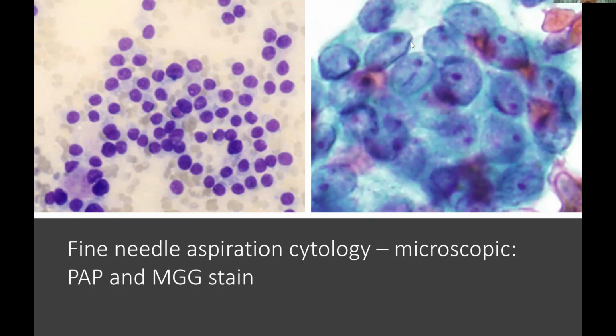The nuclear features of the thyroid cells are vesicular, meaning you can see clearing of the nuclear features. Here you can see grooving inside the nucleus. This one we call nuclear grooving. This one again is nuclear grooving, and this is a nucleolus. But in this slide, I can't see any pseudo intranuclear inclusions. Actually, this is a case of papillary thyroid carcinoma. They have the nuclear features of PTC.